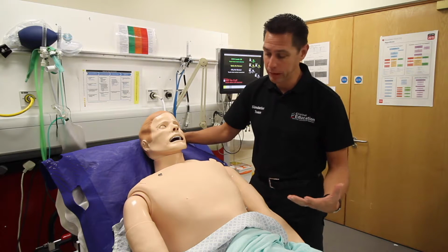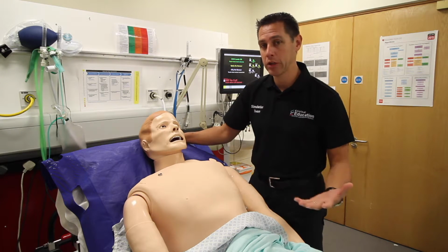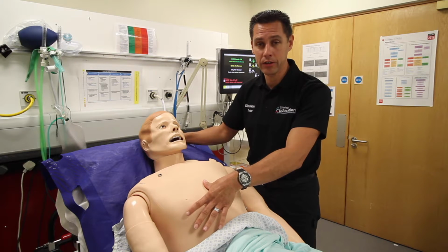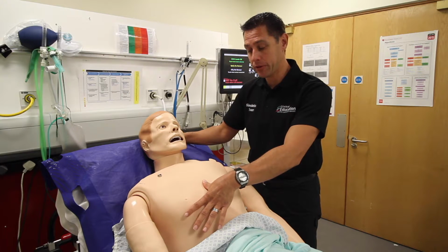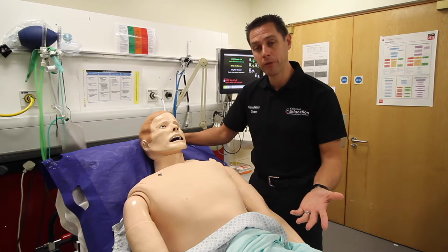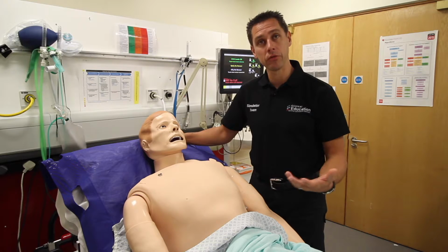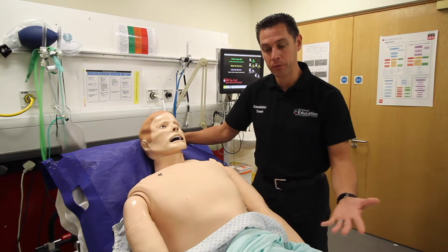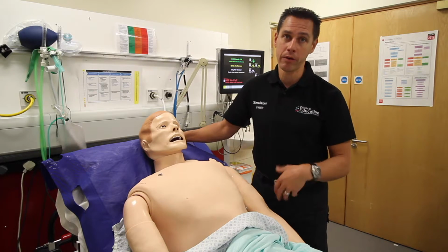So some of the fidelity for the scenario will come from the nurse within the room. So if you're thinking about doing capillary refill time, we expect you to do things in real time as you would do in reality. So you would press for 5 seconds, you would release after your 5 seconds, and then you would hope you would get the information from the nurse within the room. So the idea is that the pallor, the way he looks, will come from the nurse within the room or the plant within the room, whoever that may be.